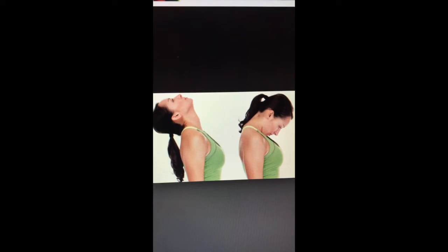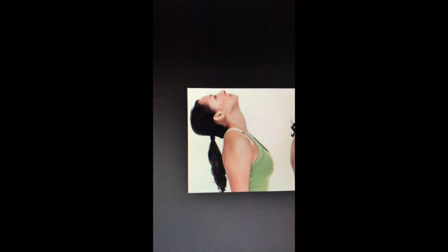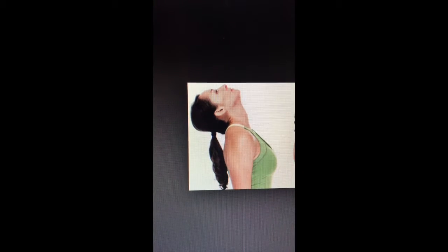These two views are the positioning for hyperflexion or hyperextension. On this, the patient can be erect in order to have a true lateral, with the shoulders down. For example, this one is the hyperextension. The patient needs to have the head towards the back, the chin raised, and the head tilted as much as possible in order to have good positioning for hyperextension.